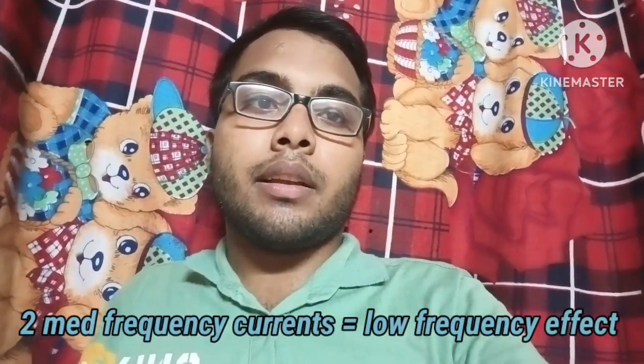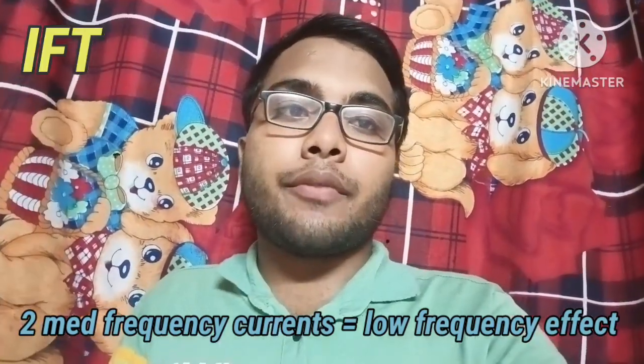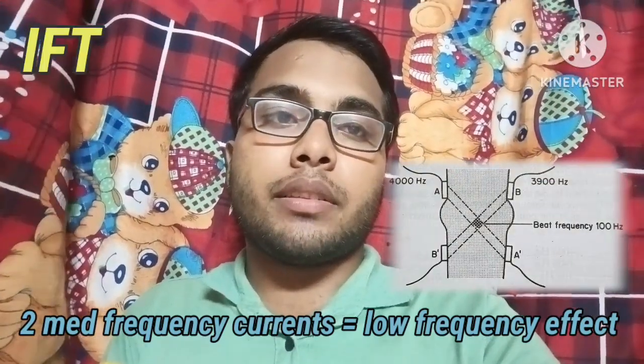After TENS, we will learn IFT. IFT means interferential therapy. It is a form of electrical current where two medium frequency currents are used to produce a low frequency effect. There is an interference effect where the two medium frequency currents cross in the patient's tissues.